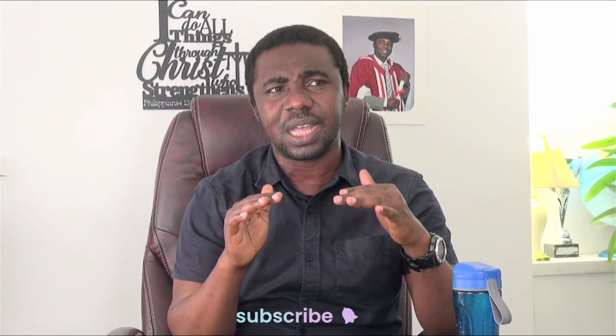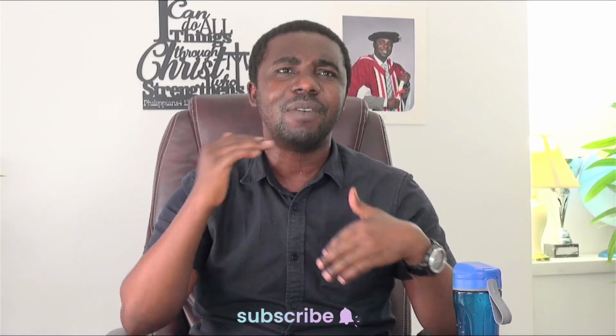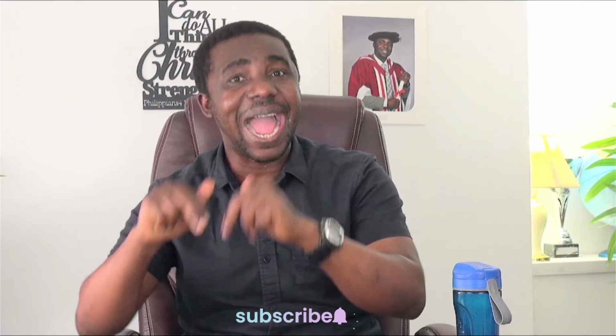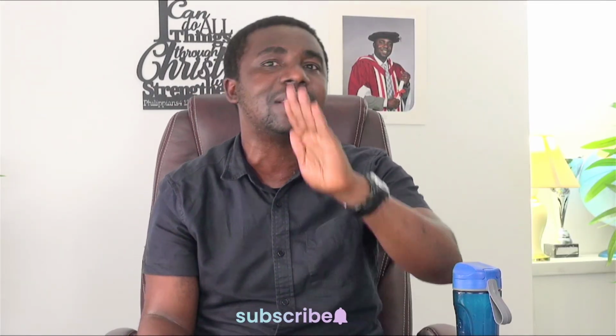Maybe I should put it this way. Let's say it's high bilirubin, and I'm validating the result, and I think that the high bilirubin would have impacted on the result, but not so badly. I can still release the result, but I'm also going to put a comment: note, high bilirubin, or sample appears highly icteric, please consider when making a clinical decision. It's very, very important, because once you release the result, the clinicians take it that the result is reliable.